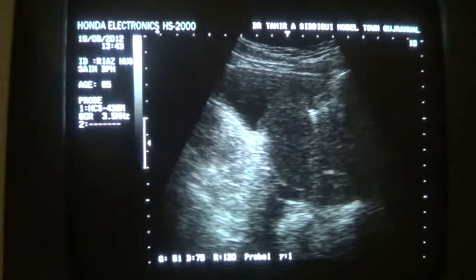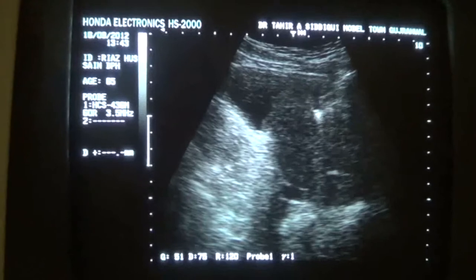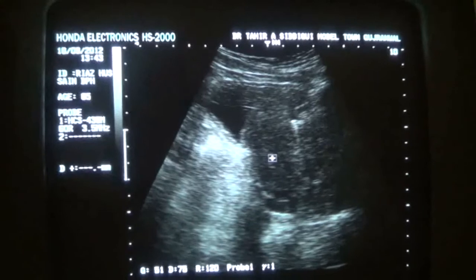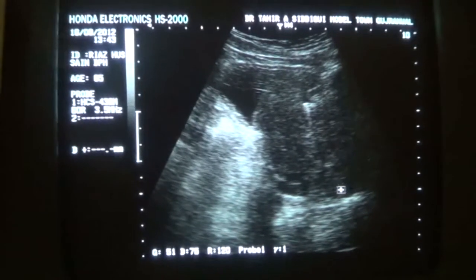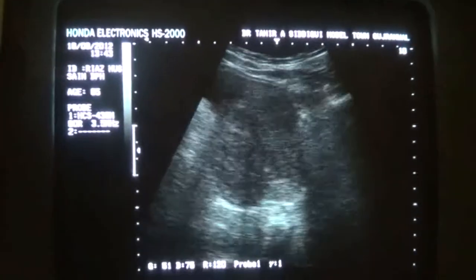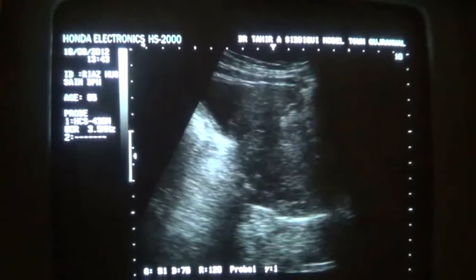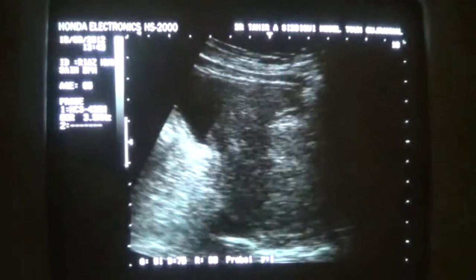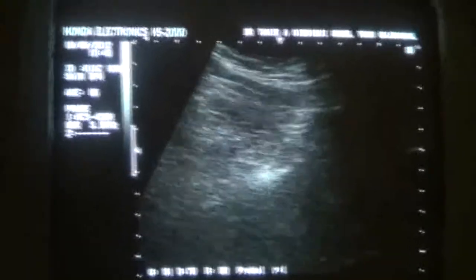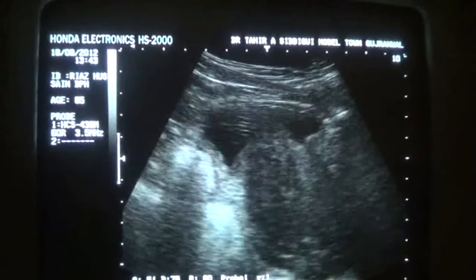Now you see, this is in fact the urethral portion. This is the urethra, and this echogenic area is calculus, in fact, because here it gives a comet-tail artifact. So PSA is mandatory in this patient. PSA कराया? एक टेस्ट होता है PSA. कराया? किसने नहीं किया? वो जरूर करो.